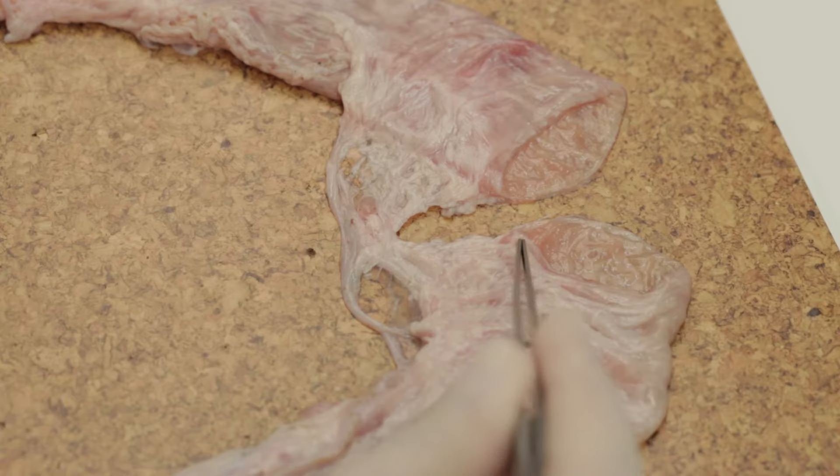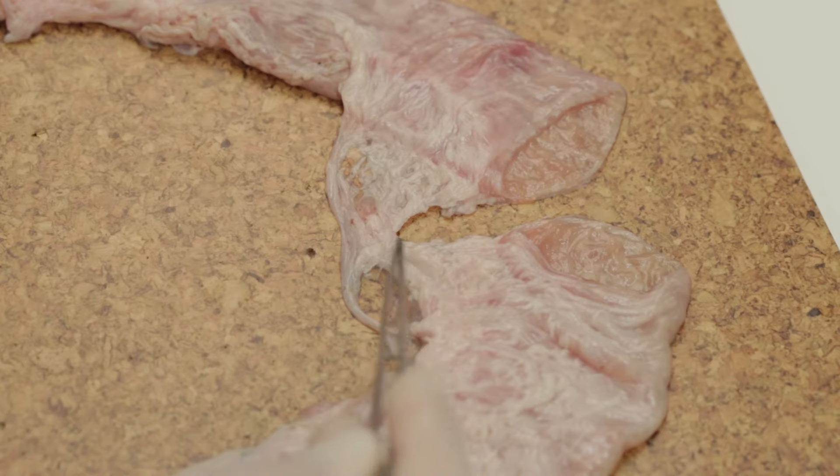This video will demonstrate a hand-tied end-to-end bowel anastomosis. There are many different techniques to performing this common procedure, but this can be taken as its simplest example. Note the two cut ends of the colon, as well as the mesentery, which has been partially divided.